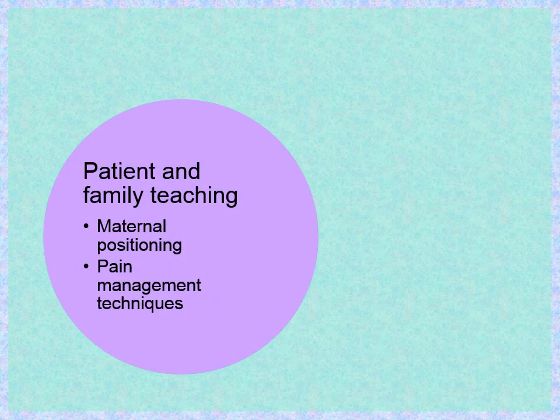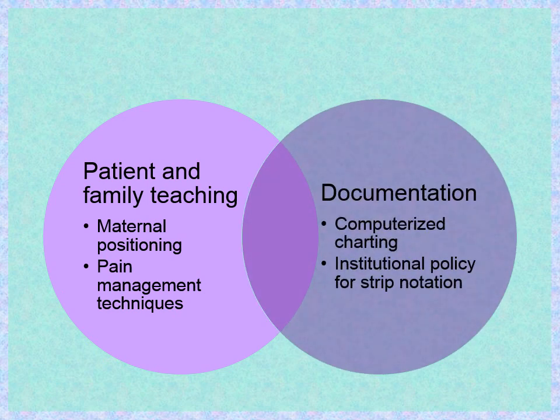The nurse should be sure to teach the patient about the reason for fetal monitoring. If any changes are made as a result of the fetal monitor strip, it is important to inform the mother of the reason for the change and to appropriately respond to the emotional, informational, and comfort needs of the patient. In most labor and delivery suites today, documentation is computerized and can be done at the bedside. However, some facilities require that the nurse physically note on the strip when she is present in the room with the patient.